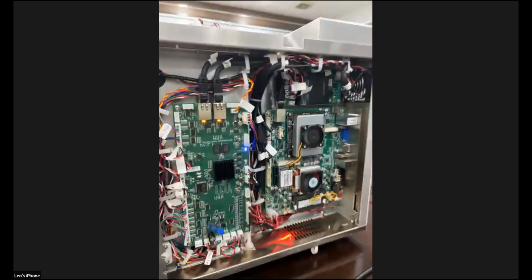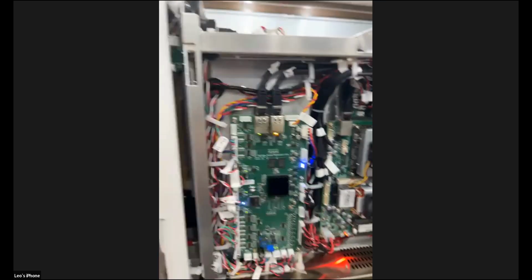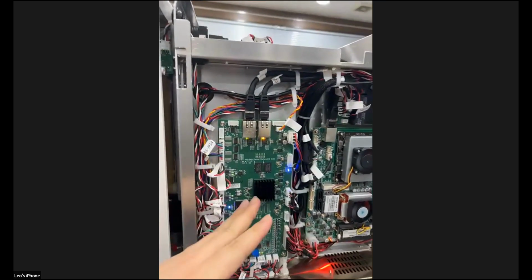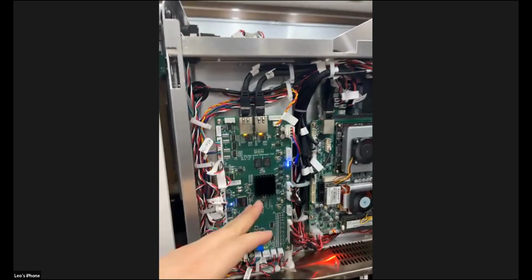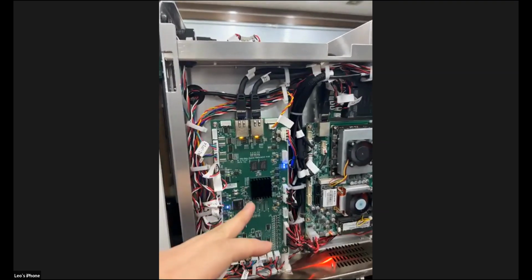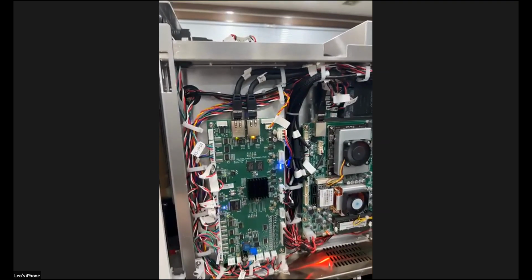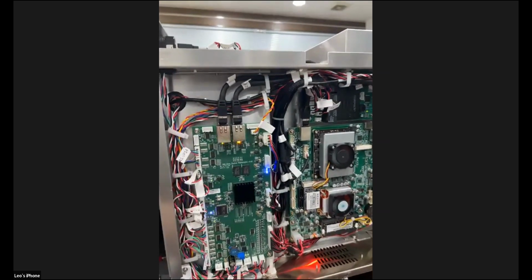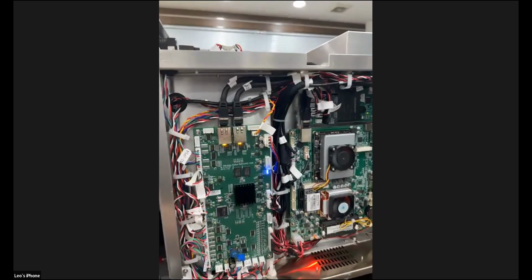This is from the right side of the machine. The first one is the control platform. We also call it the A1 board. It seems to have the same function as the 1000 plus A1 board.